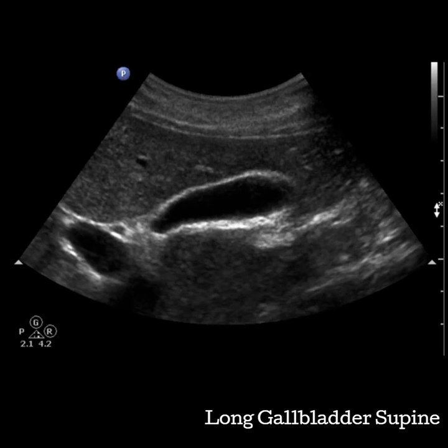The gallbladder parts include the rounded fundus, the body, and the neck. Your longitudinal image of the gallbladder should attempt to connect all three components. There are multiple windows to the gallbladder. Be sure to view the gallbladder through all of them and then choose the best one that visualizes the entire gallbladder. You may need to take more than one picture if all three parts of the gallbladder cannot be seen in one image. Have your patient take a deep breath in and hold if necessary.